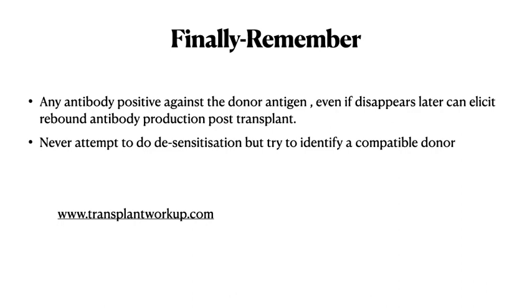So finally, any antibody positive against the donor antigen, even if it disappears later, like sometimes the CDC will be positive and again becomes negative. The flow will be positive, again becomes negative. The SAB will be positive, again becomes negative. So you can go ahead and do the transplant, no problem. But always remember that post-transplant there can be a rebound, and you should be prepared for that. Never attempt to do desensitization, but always try to identify a compatible donor.